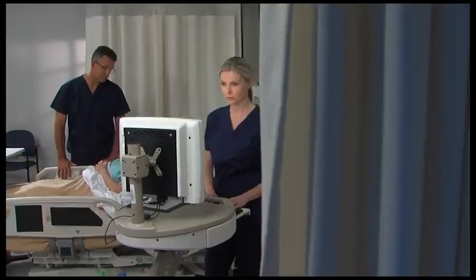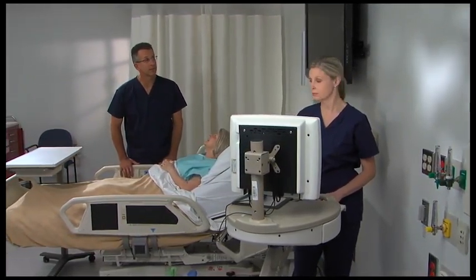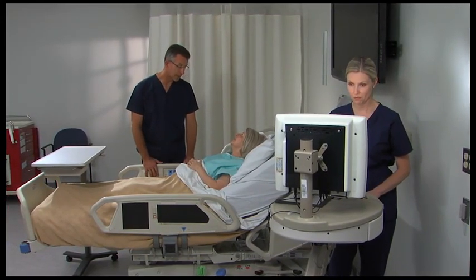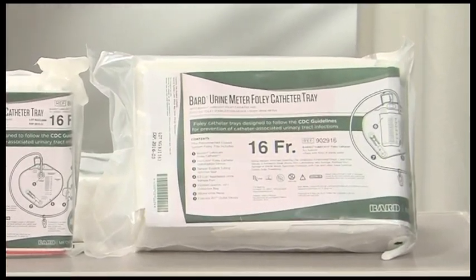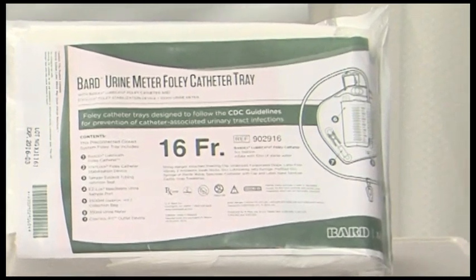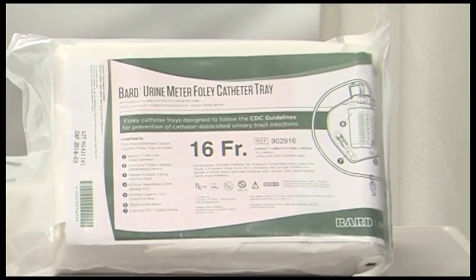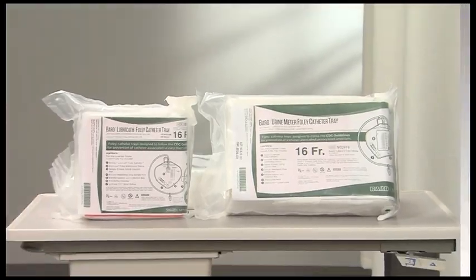Prior to placing the Foley catheter, obtain a physician order and confirm the patient meets appropriate indications per CDC guidelines or hospital policy for indwelling urethral catheter use. Choose the Foley catheter tray which best meets the needs of the patient. Use the smallest Foley catheter possible that provides good drainage. If the close monitoring of urine output is required, select a pre-connected, closed-system urine meter tray. Likewise, if the patient requires continuous temperature monitoring, a temperature monitoring Foley catheter system may be selected.